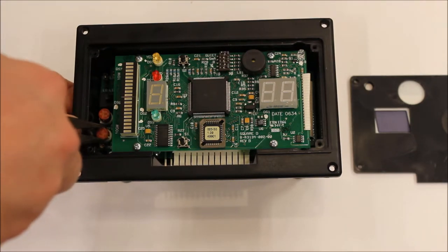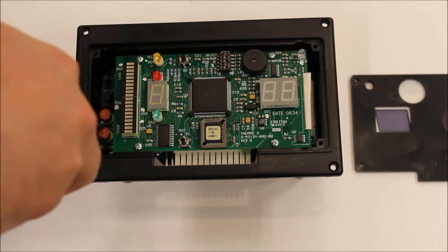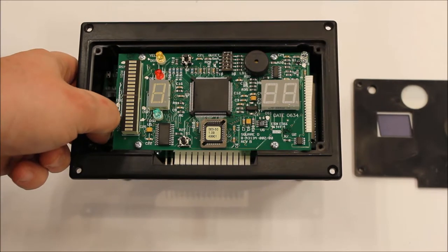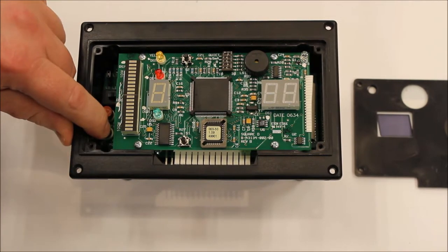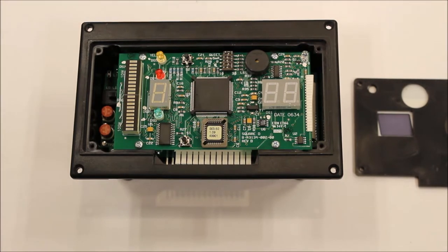Long ago, these were available from us with a part number, but that is no longer the case. At the time this video was published, an internet search for the fuses was successful. Be sure to get the kind with short leads, as shown here, not the variety with longer leads for soldering.